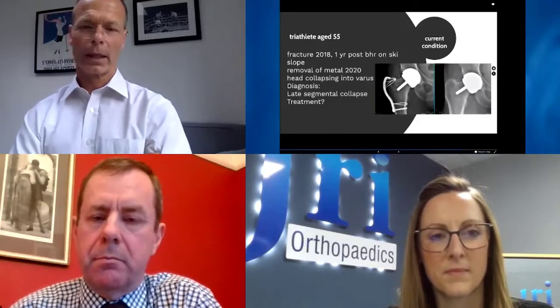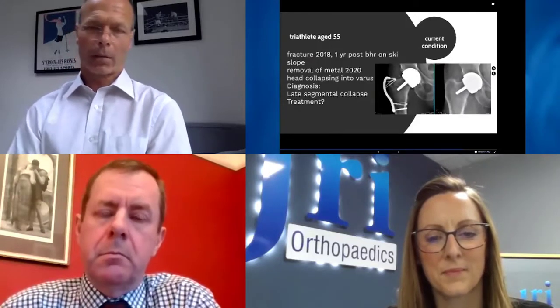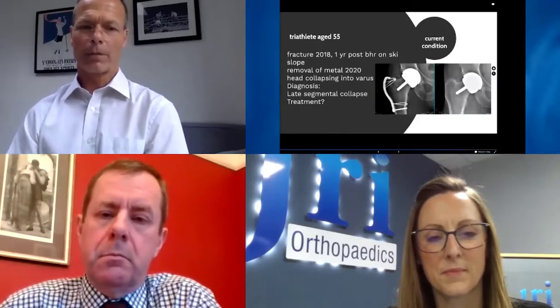So the question is, if you have a very large bit of metal in that very proximal bit of femur, what's the stress response just distal to that stem? I'm not sure. Maybe it's not going to be an issue at all. But certainly there'll be some cases where if I think I'm going to be putting a very big stem in, or I'm anxious that I won't have a big enough one, then I'll switch to the original JRI, which I still really like and use quite a bit.